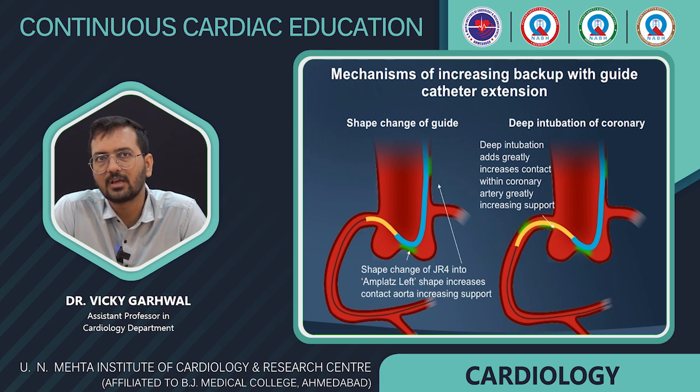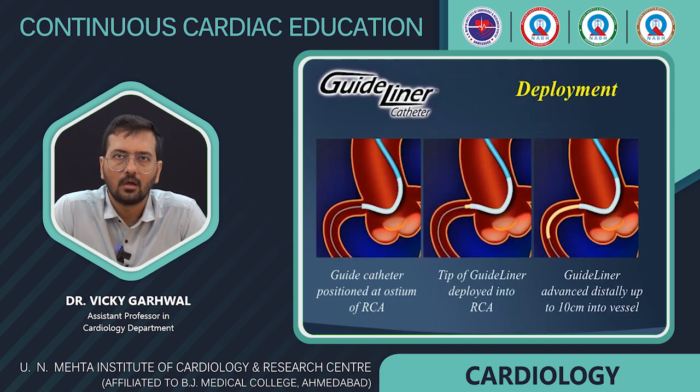So it increases the contact with the aorta and increases the support. And deep intubation increases the contact within the coronary artery also, and provides a great increase in support. And we can easily pass the stent and balloons through the guide extension catheters.